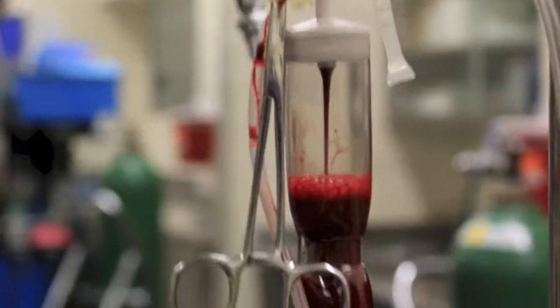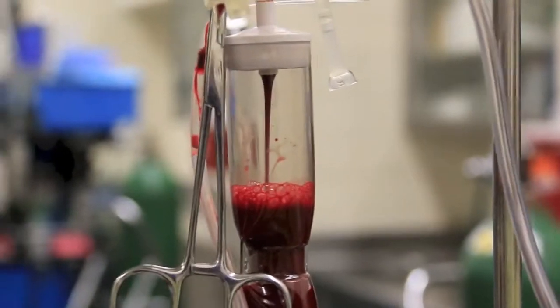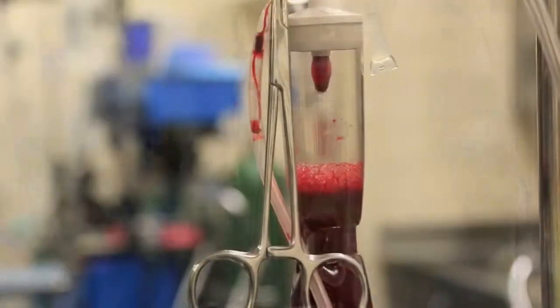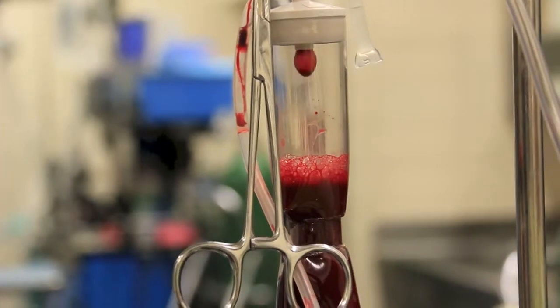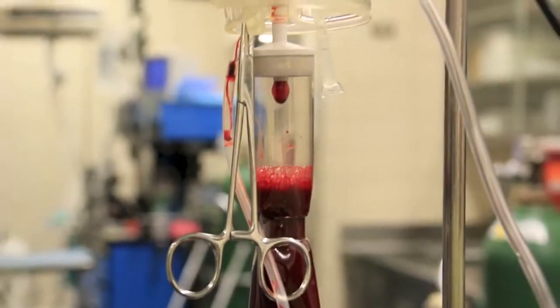Hey, just for the fun of it, drop off the pressure to zero and just see what gravity does. Not very much gravity at that — there we go. So this is gravity flow. Tom, I thought I would just show a picture of gravity.